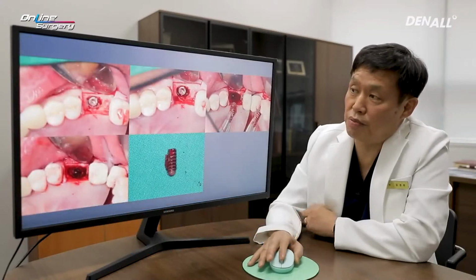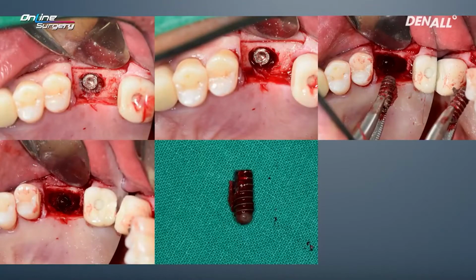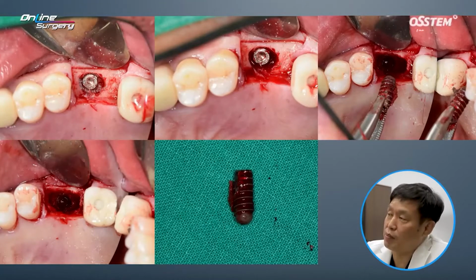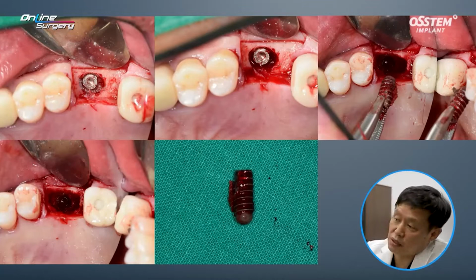This is an image taken during surgery. If you look at the image, a fissure burr was used. I gained fulcrum here. Like this, I used an elevator for implant removal. As mentioned, I tried to minimize damage to the buccal plate as much as possible. I used a fissure burr and tried to avoid the buccal side. Mesial, distal, and palatal sides were utilized to do elevation.